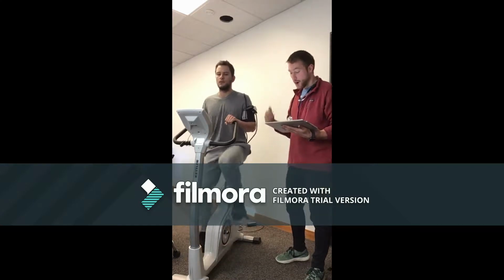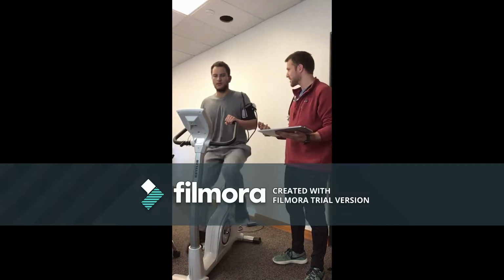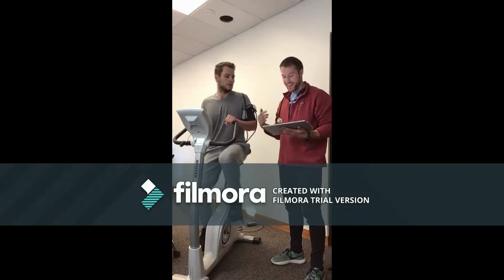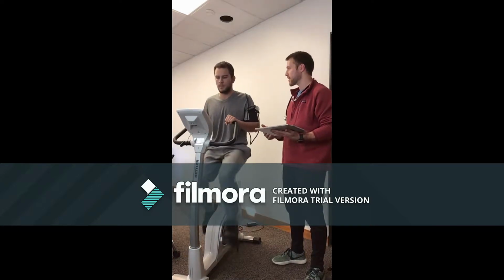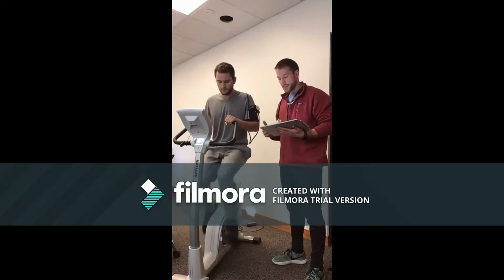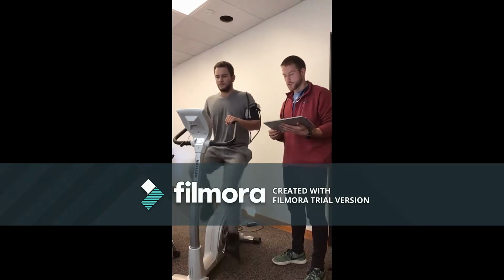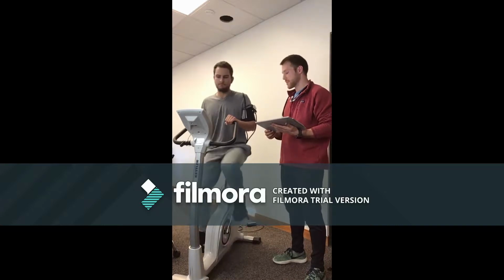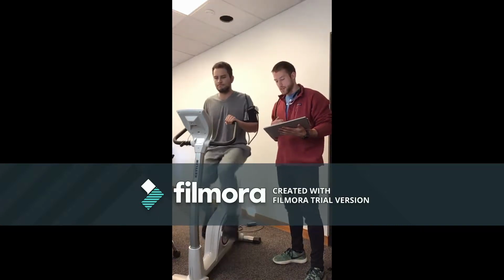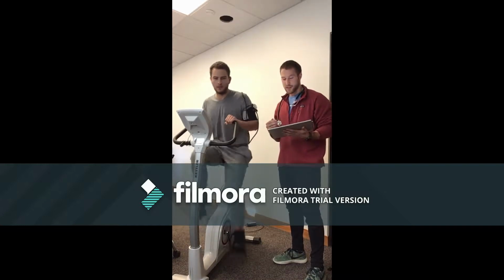We also took your resting vitals, had you sitting for 5 minutes as you remember, and then I took your blood pressure, I took your heart rate, and again we went over those ratings of perceived exertion. Just so you have it, you were at 60 beats per minute for your heart rate, you were at 122 over 78 for your blood pressure, and your RPE was 6. So that RPE, just like in your warm-up when you were resting, correlated nice and well to the heart rate.